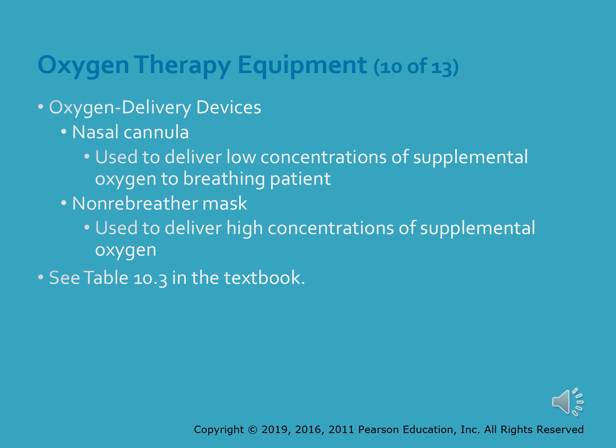A full reservoir bag will ensure that the patient will receive the maximum concentration of oxygen directly from the reservoir with each breath. This is done by using your fingers to cover the one-way valve inside the mask between the mask and the reservoir. When placing the mask on the patient, you must take care to ensure a proper seal with the patient's face. The reservoir must not deflate by more than 1/3 when the patient takes his or her deepest breath. You can maintain the volume in the bag by adjusting the oxygen flow on the regulator.